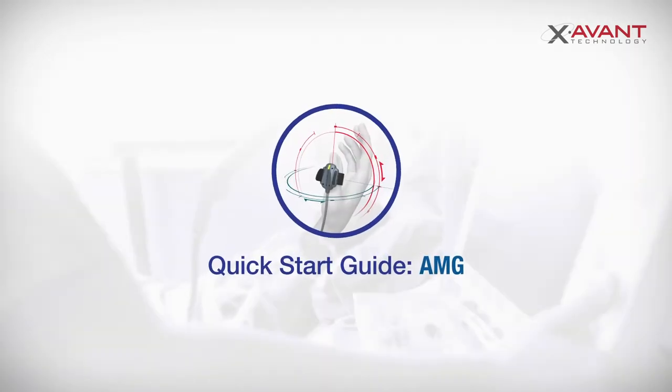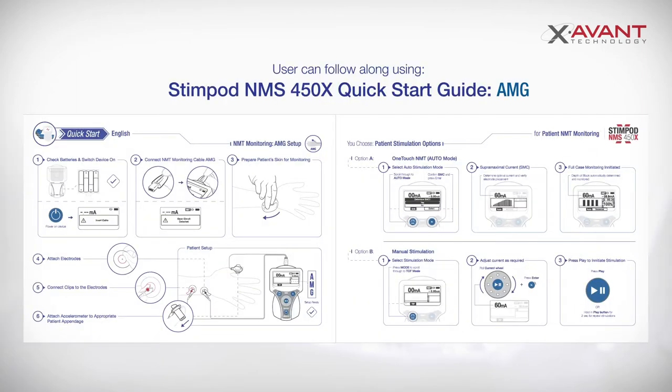Hi and welcome to our Stimpod quick start guide for AMG. This video will demonstrate how to set up NMT monitoring on a patient using Acceleromyography with the Stimpod. You are welcome to follow along using our printed Stimpod quick start guide for AMG.